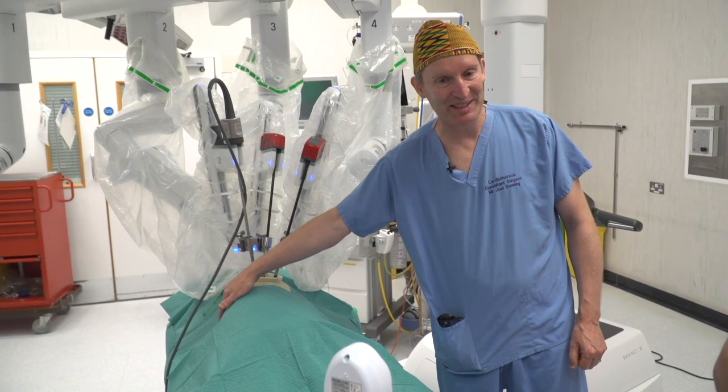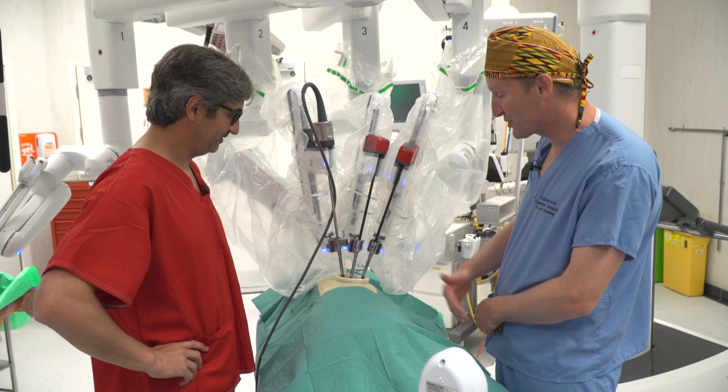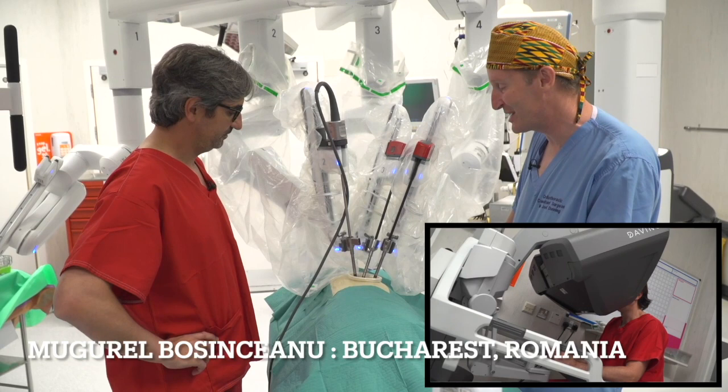So let's go to the robot. Come over here. If you want to come round, let's go and see the robot. Here we've got a kindly patient, slightly plastic, who has agreed to have a right upper lobectomy. We're also very lucky to have Mugurel, who's on the console as well, from Romania. Thanks for coming. Maybe talk to us about the key points that make this possible.